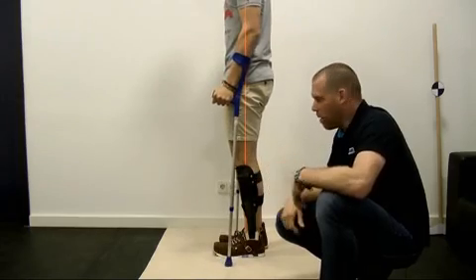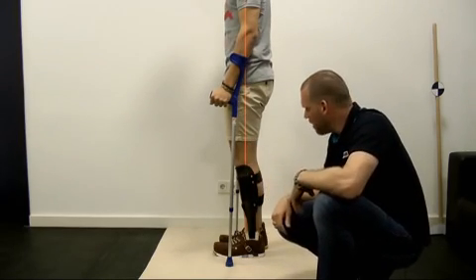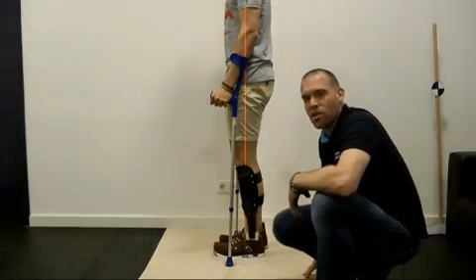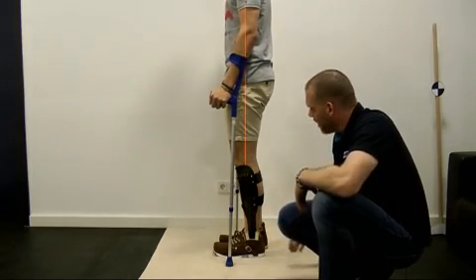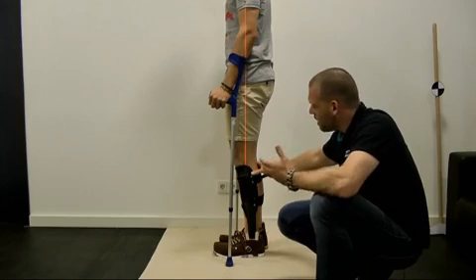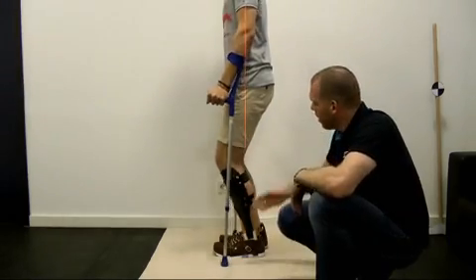However, as we have just learned with the broomstick, the ideal basic alignment is not everything we need. The next question would be, can he also use the supporting surface that is available? That is, if he were to stand in a less ideal position, for example, with a flexed knee, because his knees are not straight, perhaps due to a flexion contracture, would Henrik be able to stand despite the less than optimal alignment?